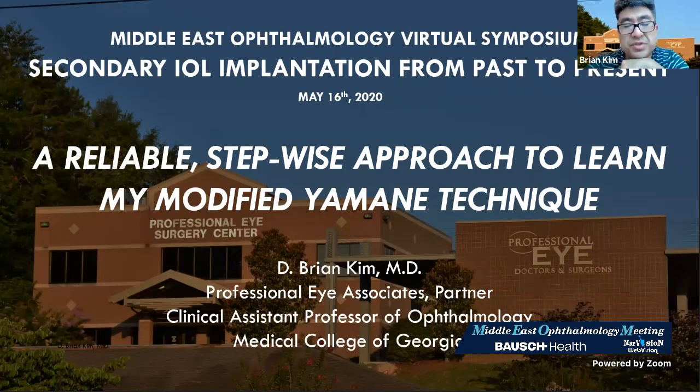That's just with experience, but I've seen some videos where doctors have been marking with an ink pen 2 millimeters from the tip of the needle. My only concern is putting that ink into the vitreous space. But the few surgeons I talked to who did that said they didn't have any complications. So I think it's not a bad idea to ink it, but make sure the ink is dry before you place it into the vitreous space.